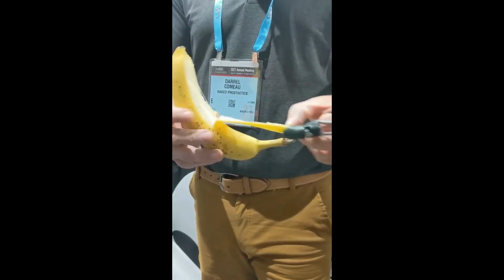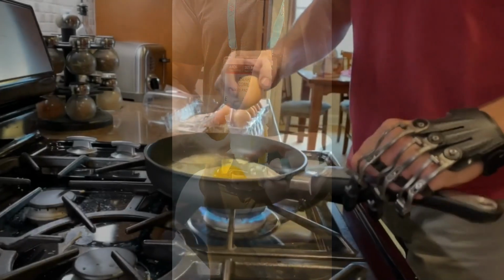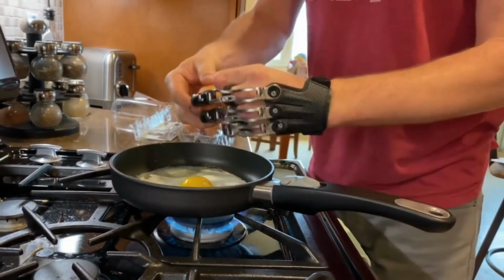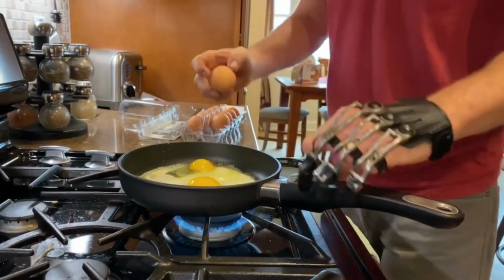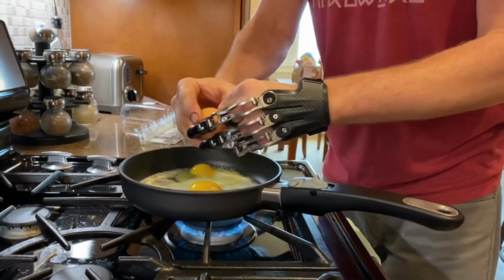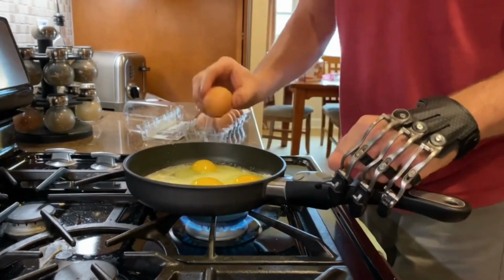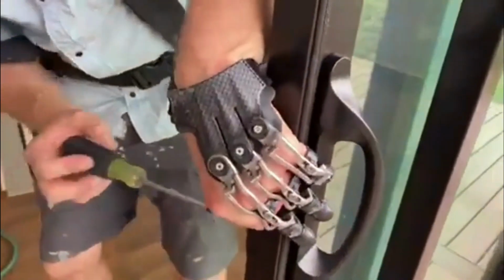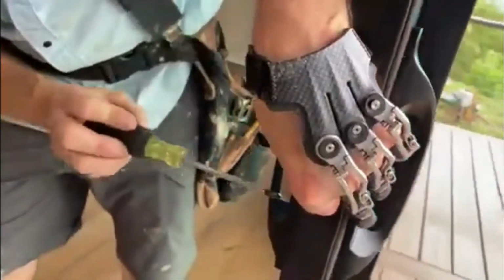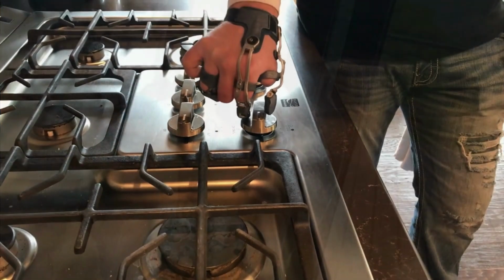I'd say one of the things that stood out to me when I was first learning about these devices, because I think all in all, in terms of the prosthetic world and the advancements that have been made in them, this is definitely one of the newer designs or options for patients. Not that they're that new, but again, in the big picture, they kind of are. It would be the amount of dexterity that the patients are gaining and some of the precise things that they're doing, such as cracking an egg or typing on a keyboard, and all these different scenarios and activities that these patients are able to do in terms of getting their life back and getting function back.